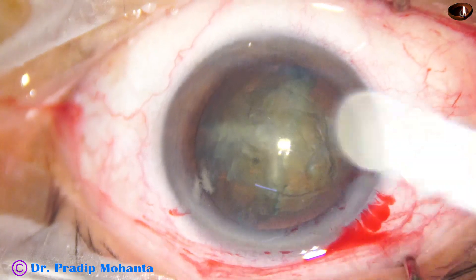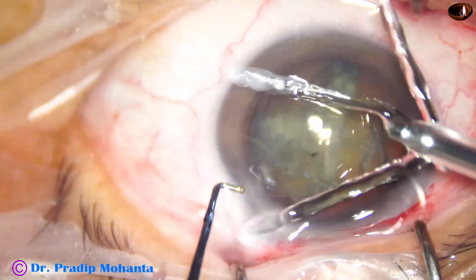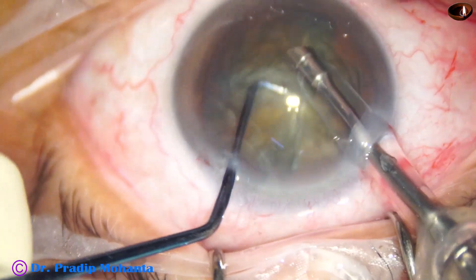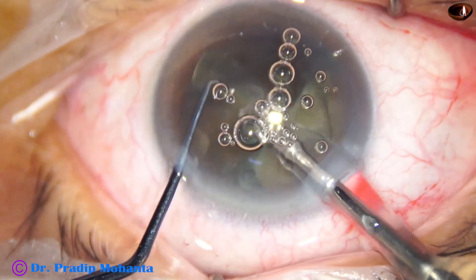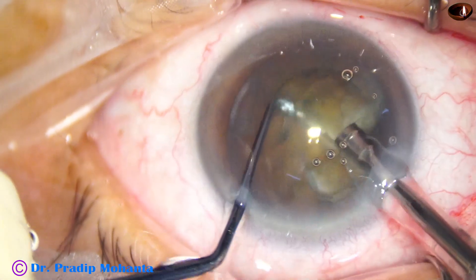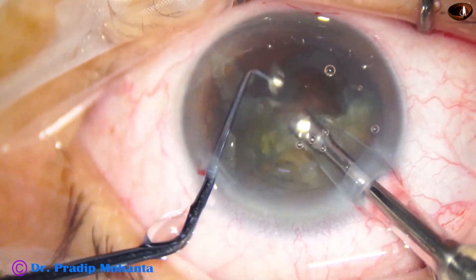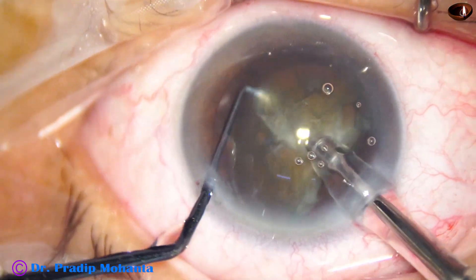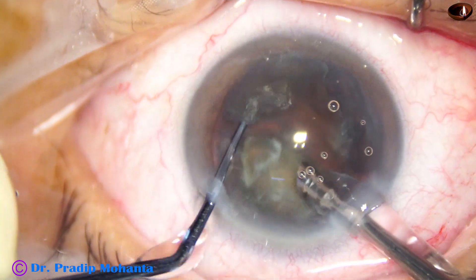The handpiece goes in with its bevel down. Some superficial cortical lens matter is removed and this piece of nucleus is brought to the center and emulsified. We go to the other piece — see how easily we can pick off the pieces. Now this hemi-nucleus is easily divided into two and then the pieces are emulsified.